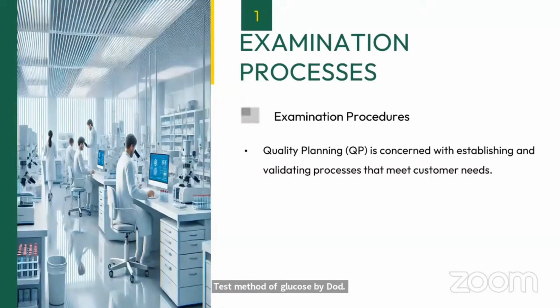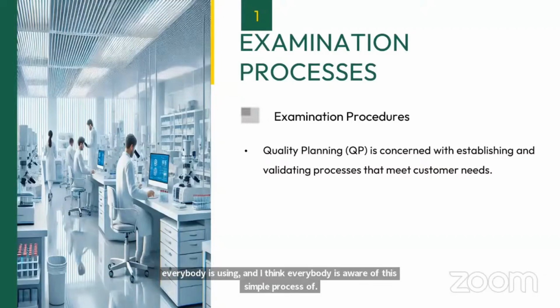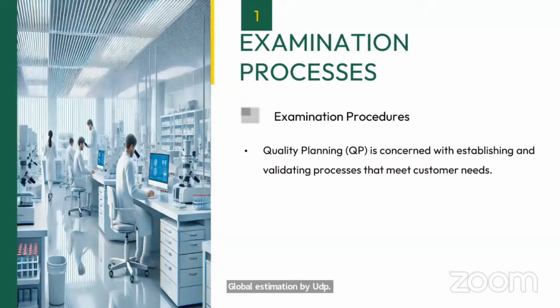Very commonly used, everybody is using, and I think everybody is aware of this simple process of glucose estimation by GOD-POD. So everybody is well versed with this procedure. It is quite often validated and it is validated since long. So there is no challenge.